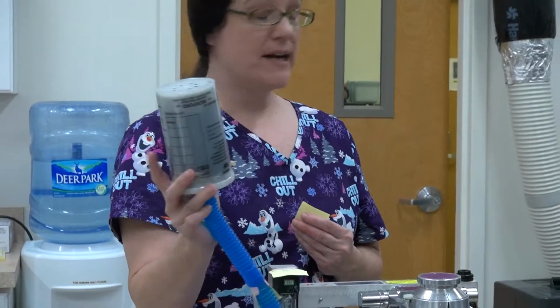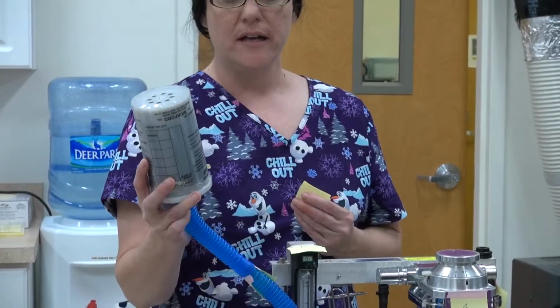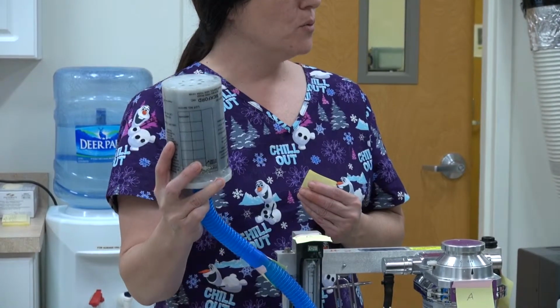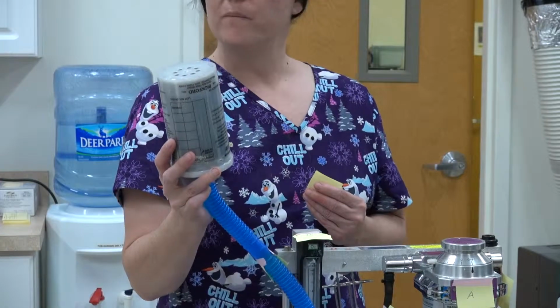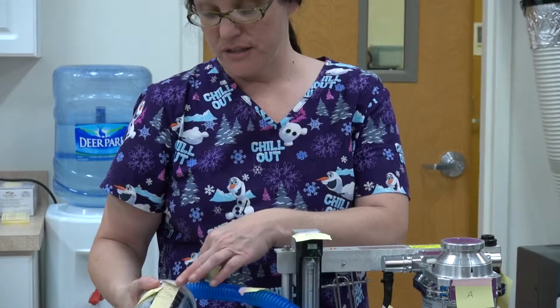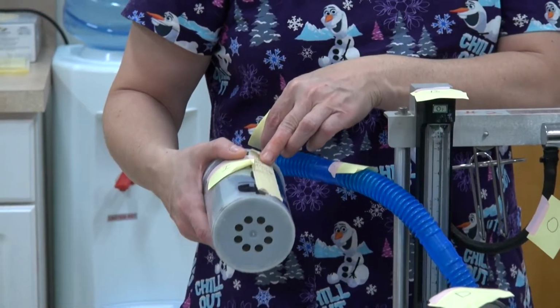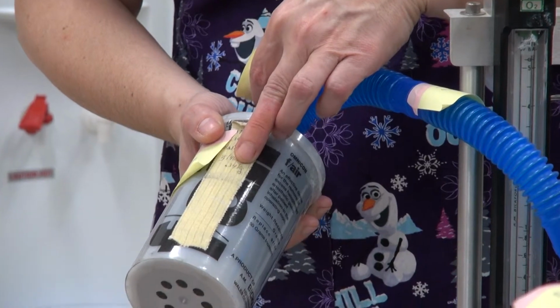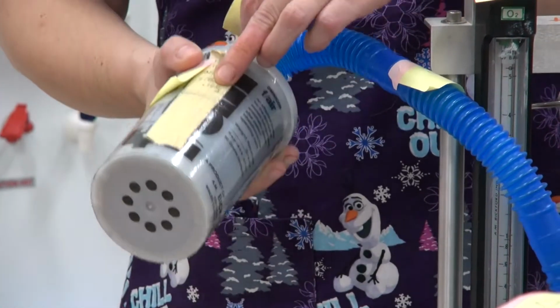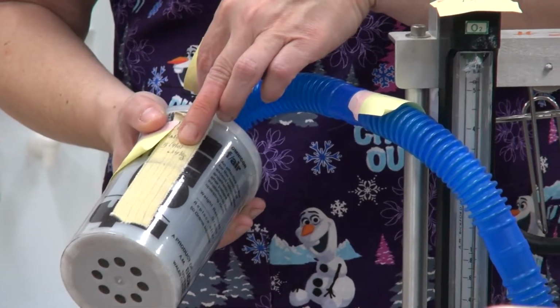Scavenger canister or F-air canister, either one is fine. How do I know when this is done? The number of hours logged. As you can see on this canister, they have the date on this one, and they have different times that the canister was used. Once I hit about 8 to 12 hours, this canister is no longer in use, and we need to get a new one, correct?